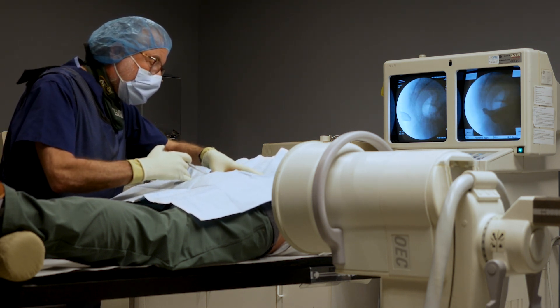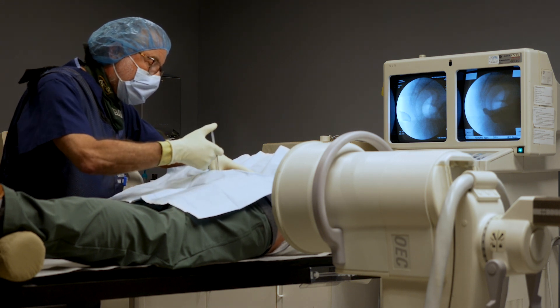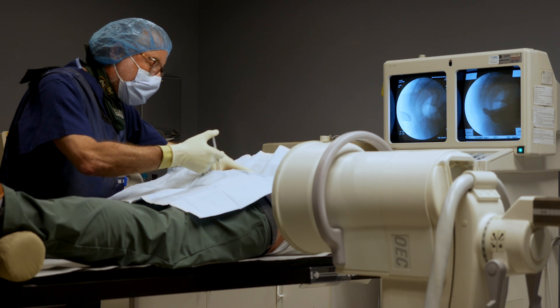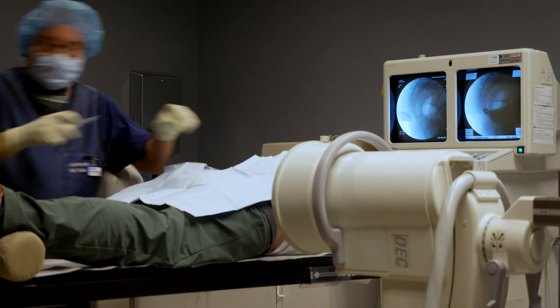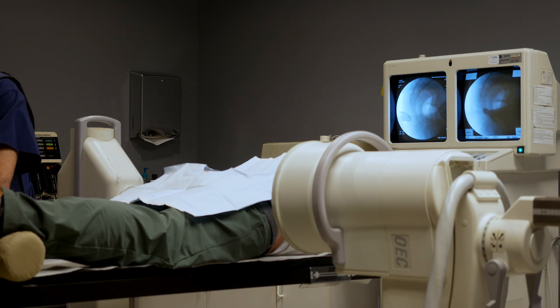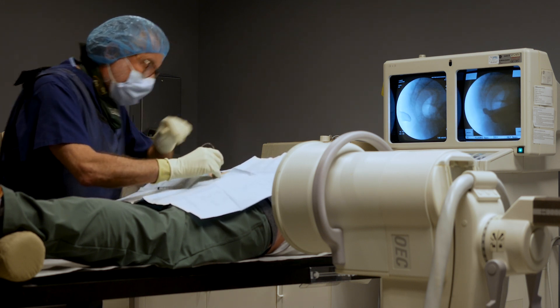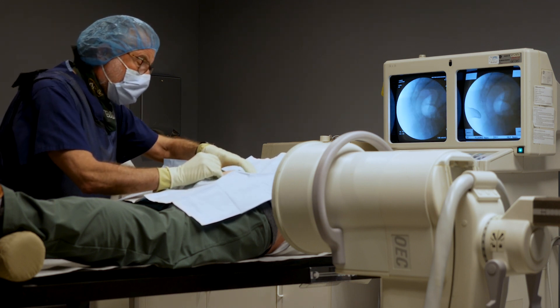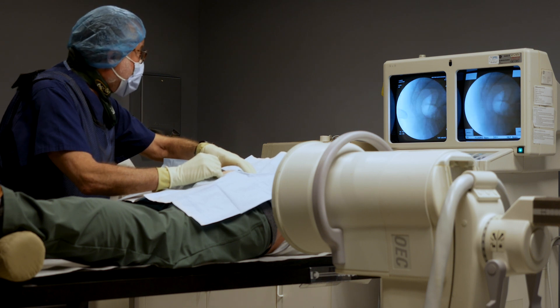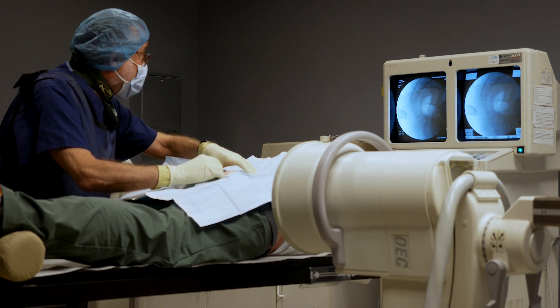A little pinch on the right side here. Right like that. So that's touching the coccyx, and then you can just walk it off. That's touching the coccyx — walk it off until you get past it.